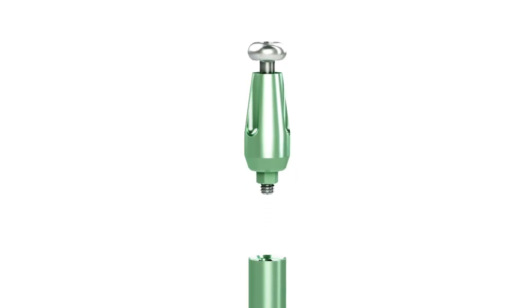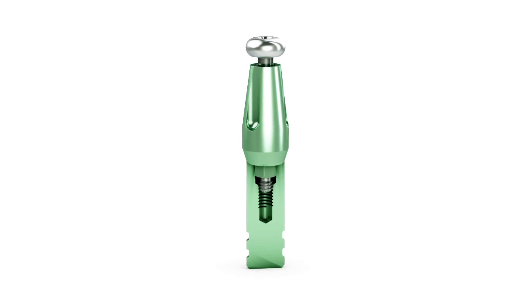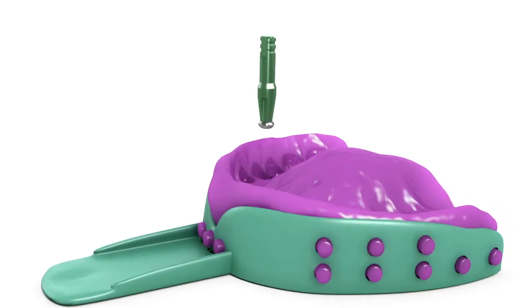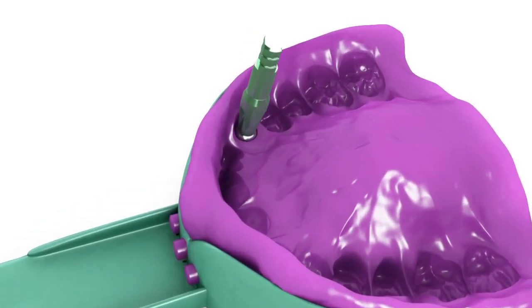Attach the appropriate diameter implant analog to the indirect scoop coping using the coping screw. Index the coping into the impression by inserting the coping assembly into the corresponding location in the impression.